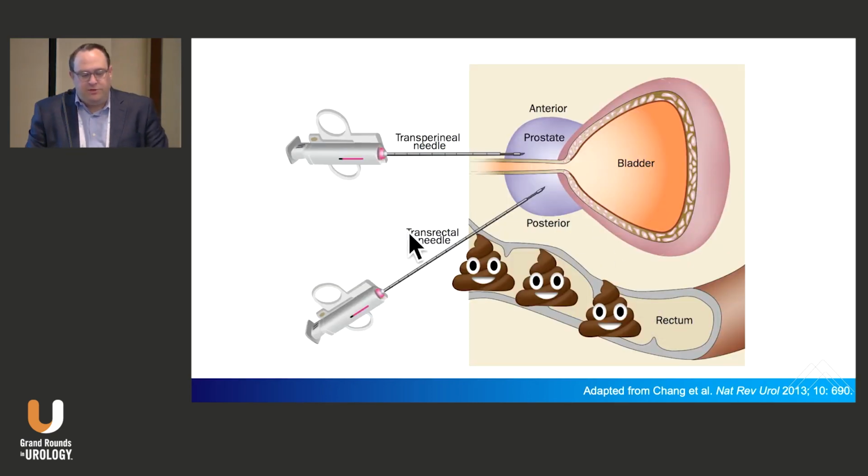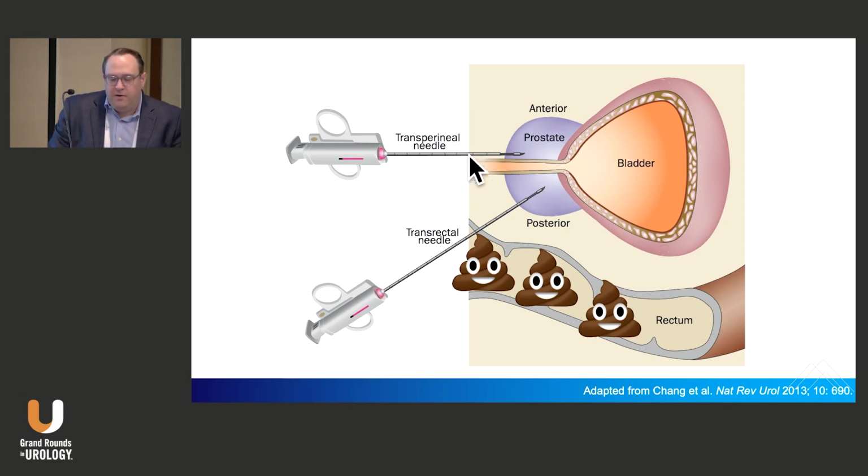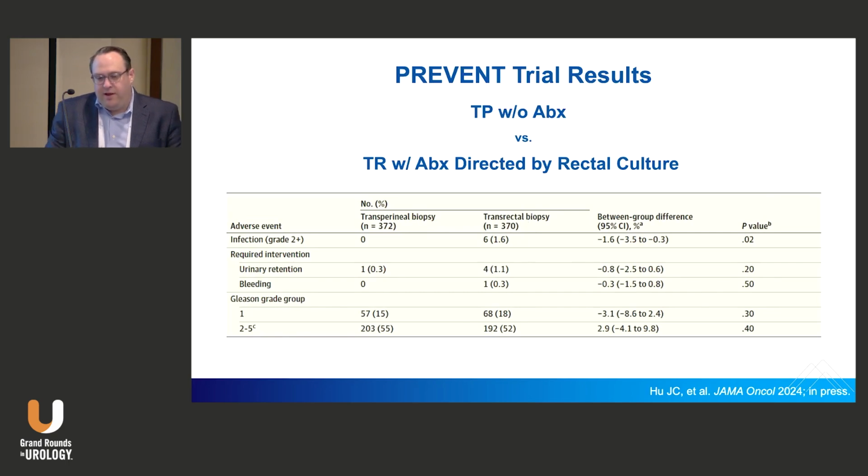So cutting to the chase, there is an alternative approach for performing prostate biopsy, and that's through the transperineal route, which is percutaneous. So the needle's actually going through the skin between the scrotum and the rectum, avoiding the stool. Now, it is true that an ultrasound probe still gets placed in the rectum, allowing you to visualize the prostate, but because this needle is never in contact with stool, it's, at least in theory, a safer procedure. And it's more than a theory at this point. It has been clearly demonstrated in the literature to be associated with improved infectious complication outcomes.